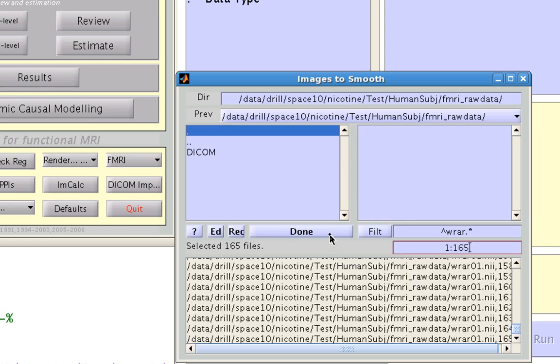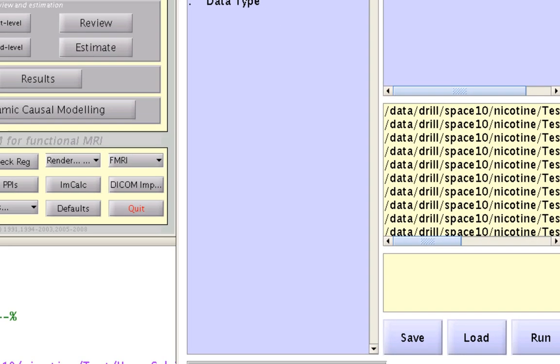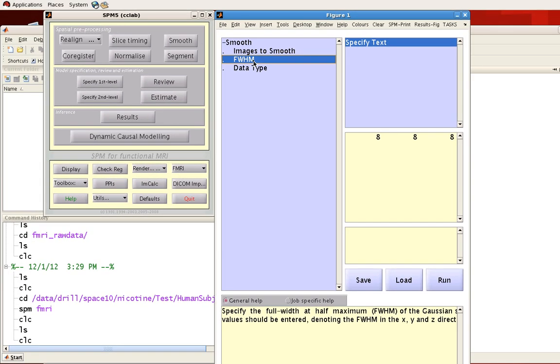Select all these, click done. And for the full width at half maximum, this is the size of your smoothing kernel. Now the default is 8 millimeters, and notice that this is in all of the X, Y, and Z directions.